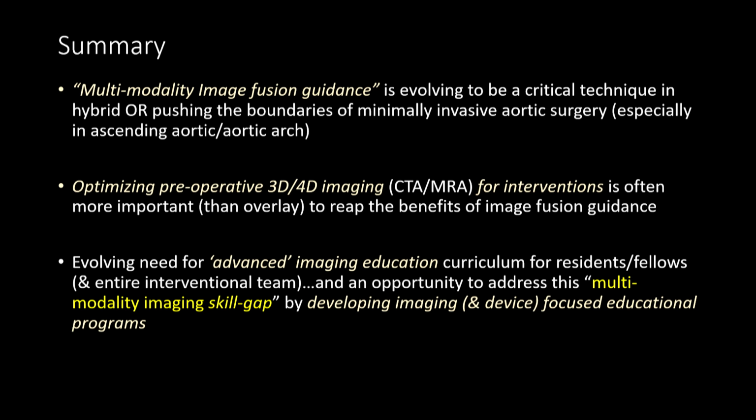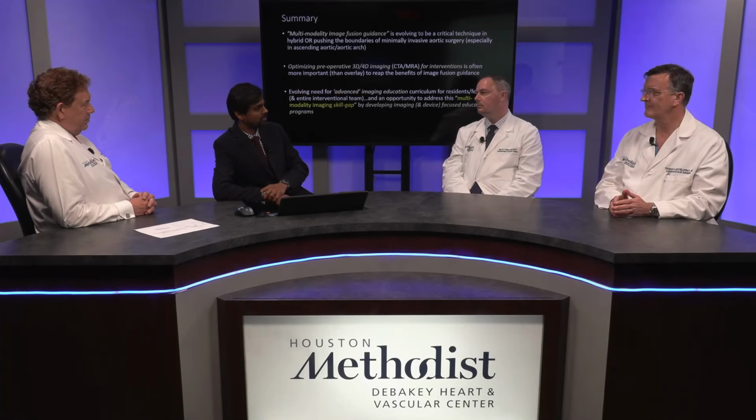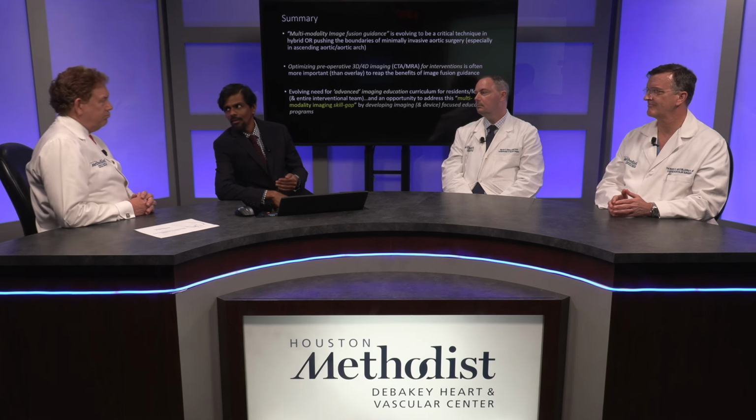More often the emphasis has been focused on the overlay and all these fancy lines that we put in. I would say the focus is often better, and the return on investment is greater, if we start thinking about how we optimize our diagnostic imaging for the underlying question that we are trying to answer. That sounds like a topic for another evening.